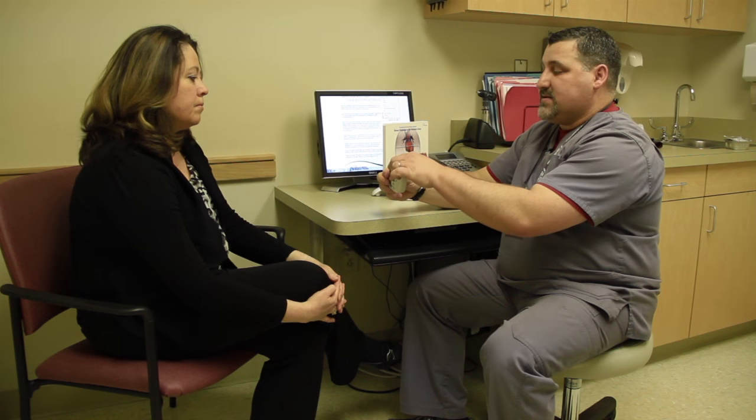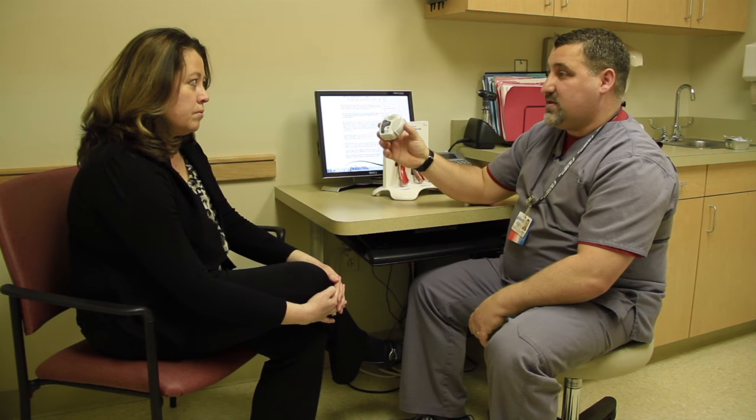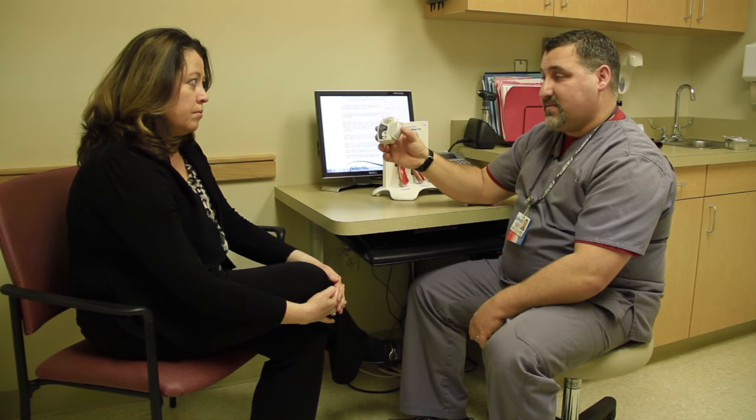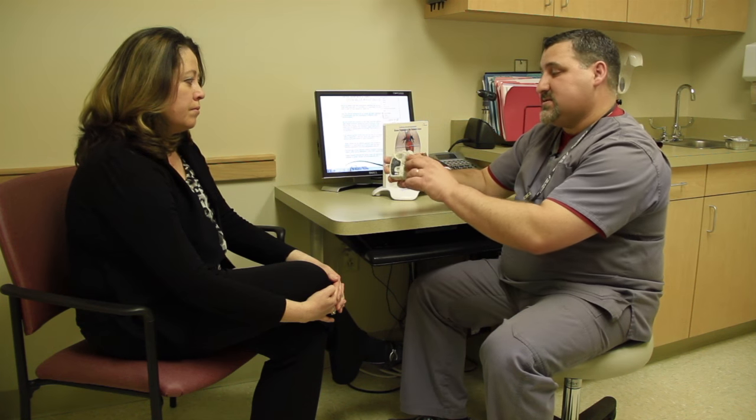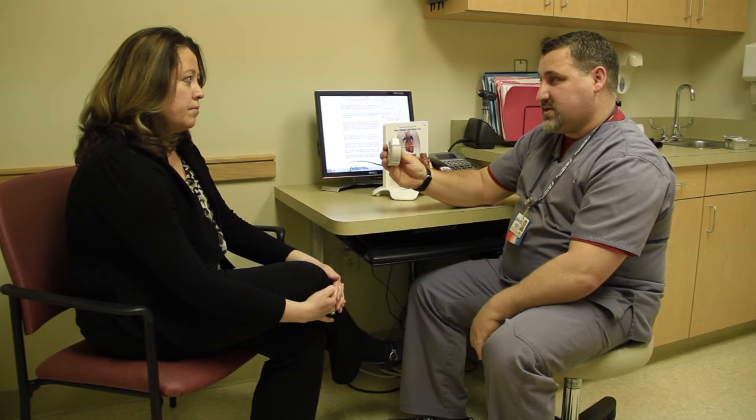When you open the lid and load a dose into the inhaler, it will only load one dose at a time. You cannot overdose even if you were to open the lid several times — it only provides one dose.